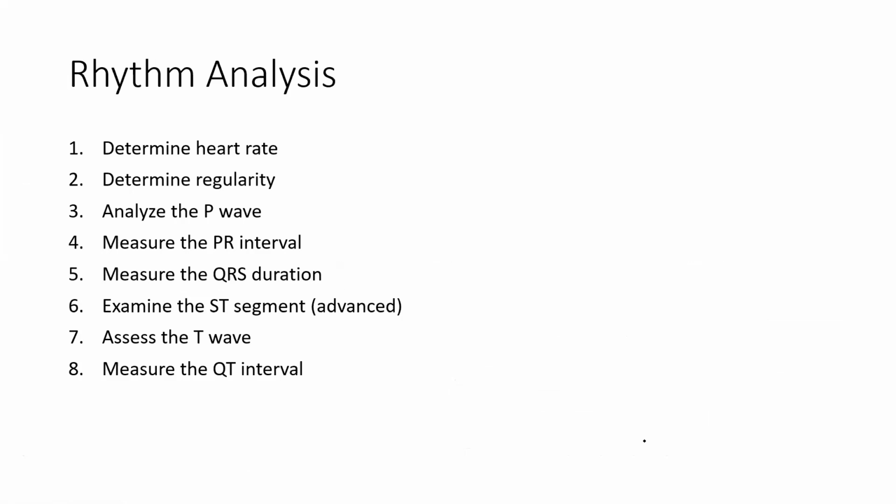We're even going to cut that down a little bit more to about the first 5 steps when we're talking about basic interpretation. Because when we get into the ST segments, the T waves, the QT intervals, et cetera, we start talking about more advanced cardiac concepts. And that's outside of what I want to talk about. I really want to just get down to, how do I look at this rhythm, tell me if it's okay, and if it's not okay, then I go to the advanced things.